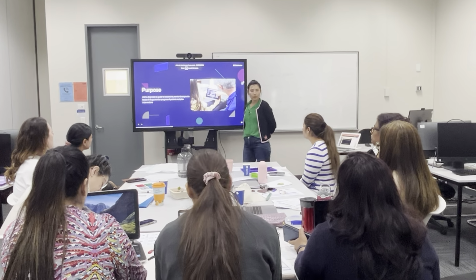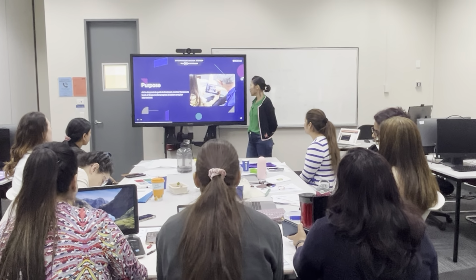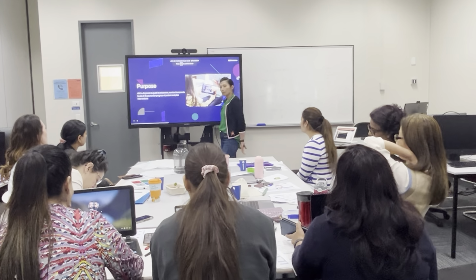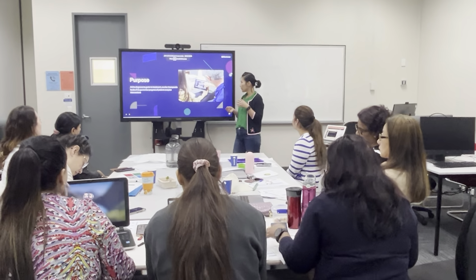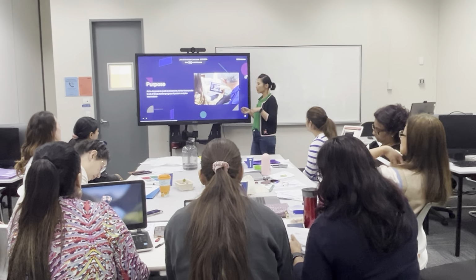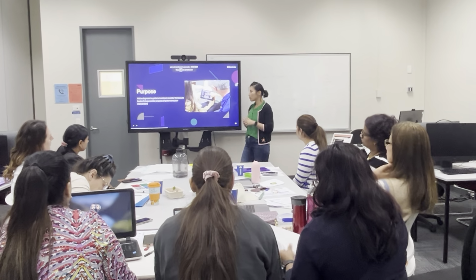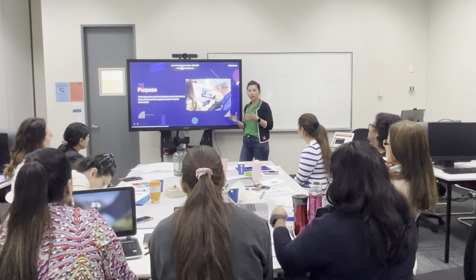So the purpose of today's session is to teach you how to collect specimens other than blood. But you probably want to know, why do we need to collect specimens other than blood? Because the blood specimen can tell us a lot of things, but some other specimens are still required to aid diagnosis, guide treatment, monitor the therapeutic level of drugs, monitor the progress of patients, and also plan interventions.